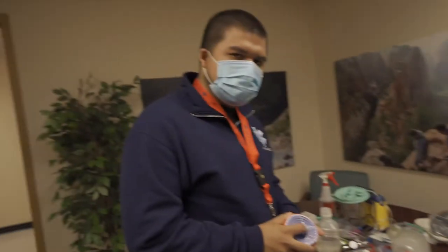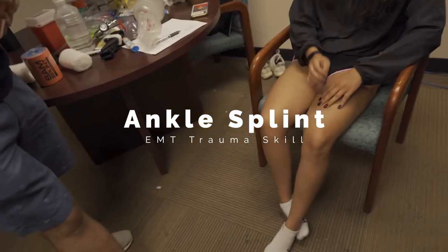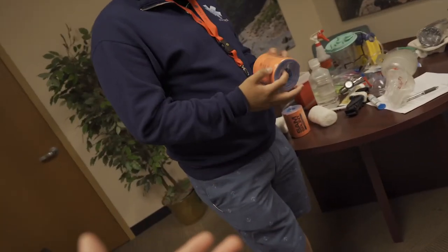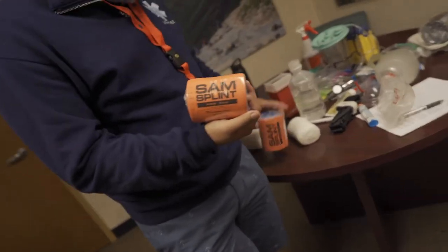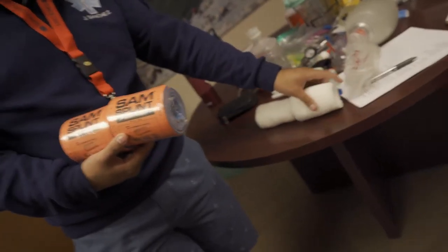What's going on guys? We've got Vary and John, and then Diane in the corner. We're going to perform a splint — we're going to splint Vary's ankle with two Sam splints. Sam is the manufacturer. You're going to need two Sam splints and two rolls of Curlex bandages.